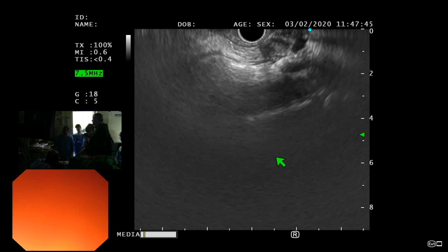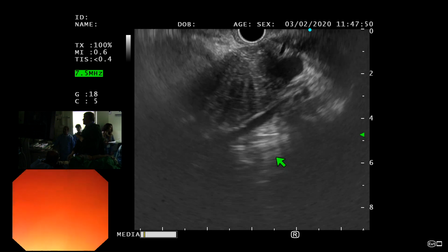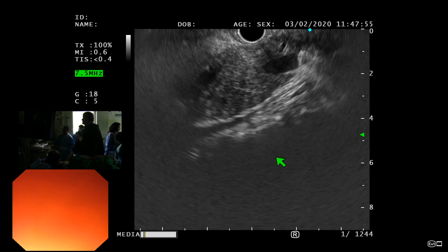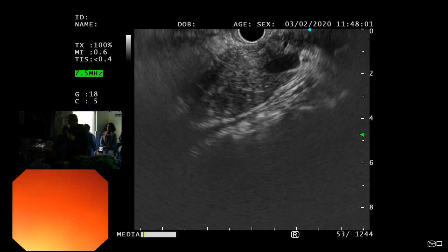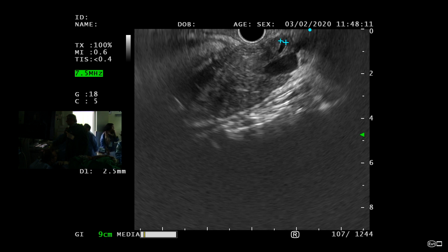क्योंकि ये head के बाद ये pancreas is really atrophic beyond. यहाँ नज़र आ रहा है, एक मिनट ठहरो ज़रा, pancreatic duct measure करनी है. ले लो ये, take it there, picture. हटाओ इसको यार. Can you see the pancreatic duct? Yes, we can. 2.5 at the level of proximal body neck. Chhod do. Yes. So I don't think I'm.